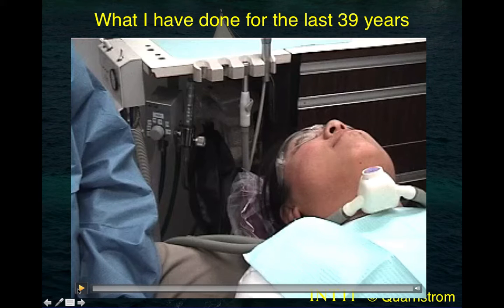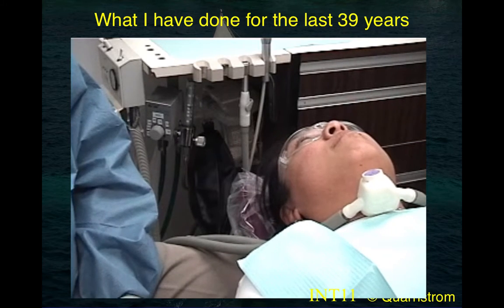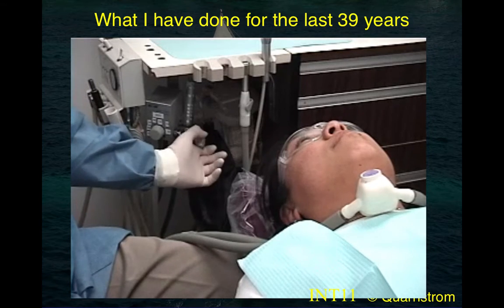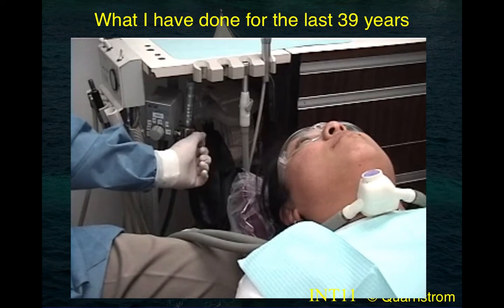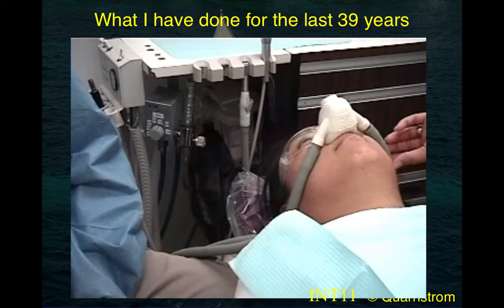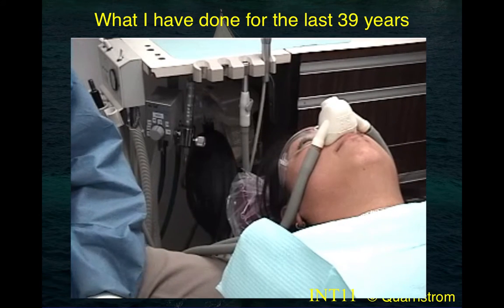So here's one of my favorite patients. This is my daughter. We've noted in the chart that she got along very nicely on 30% nitrous oxide. We're not in a rush this afternoon. She's not in pain. We don't have any reason at all to try to get her sedated quickly. So we know she's going to use 30%. We dial up our 30%. We dial up our minute volume here of 5 liters per minute, and we put the mask on. And then we take a look at the chart, see what we're going to do today, get any equipment in the room that we need to have in the room, etc. And she'll be relaxed in about a minute.